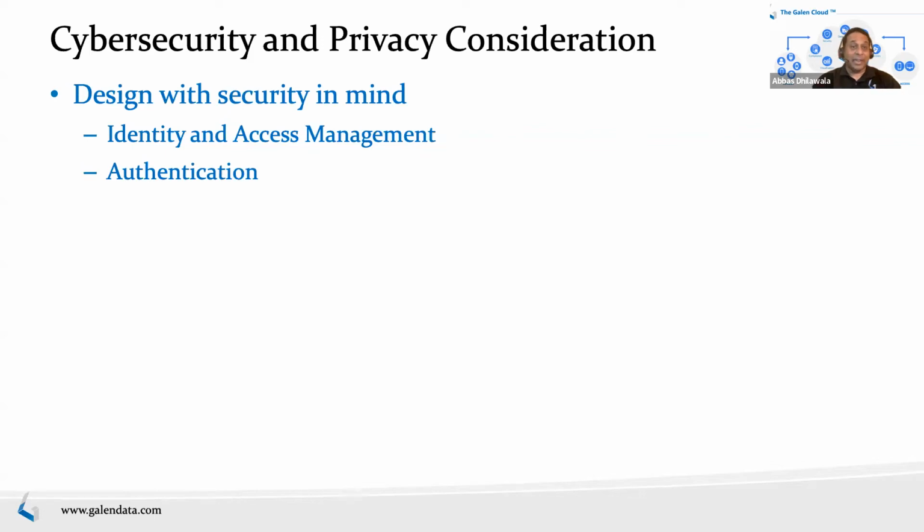If a device is going to send data, you want to authenticate both ways: that the device is sending to the right thing, but also that the right thing is sending data to your backend or your cloud, so that you're not getting fake or wrong data. And then encryption has become so accessible and easy now, with a lot of software libraries and hardware accelerated modules, that it's almost a given that you want to encrypt anything you transmit over any sort of network, whether it be Bluetooth or Wi-Fi or cellular or whatever other mechanism.